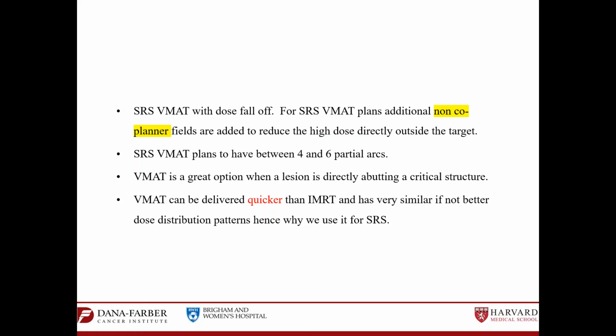In that way, you will concentrate your dose on the brain metastasis, avoiding the organs at risk from different angles. So that is the choice of non-coplanar fields, meaning you have couch kicks while you're setting up your fields for the planning.